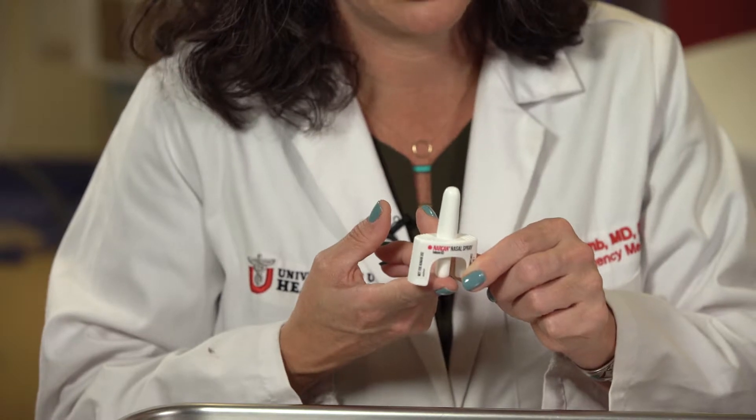You pull, you place, you push — it's very simple. Be very careful, though, that you don't push too early. If you push on this plunger before it's in the nose, it can result in the medication being dispensed. And once the medication's gone, that's it. These are one-time use only.